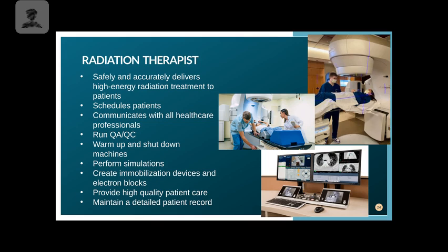Even if the patient's not very talkative, but just saying, "Hi, how are you? And how's your day going?" Things like that. Putting a smile on your face then also can reciprocate and improve their mood. We also have to maintain a detailed patient record of everything that we do. Patient setup, what their distances were, if we're trying to take pictures of the setup, all of those things.